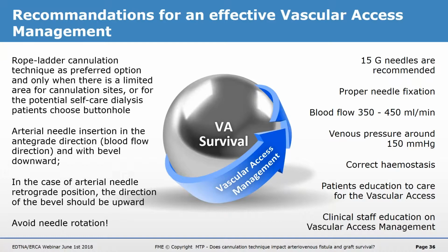And another very important point is the clinical staff education on vascular access management. We should not take anything for granted. There is always something to learn. Procedures improved. What we were doing 30 years ago, we detected later was not the best procedure. So we really have to keep ourselves up to date to make sure that we cannulate and care for the vascular access in the proper way.